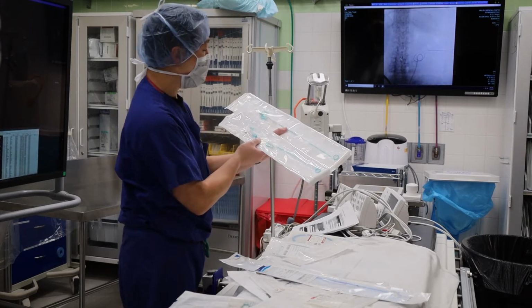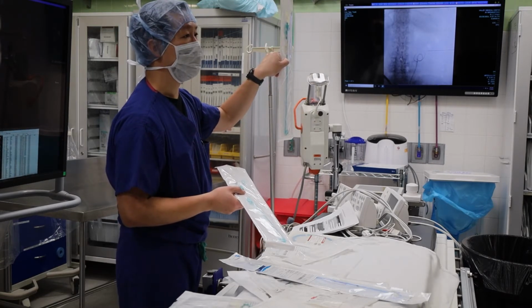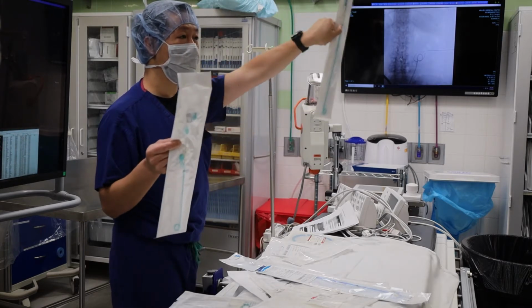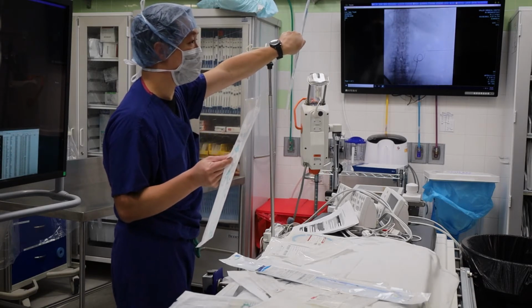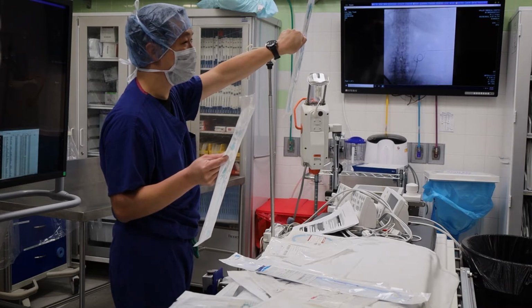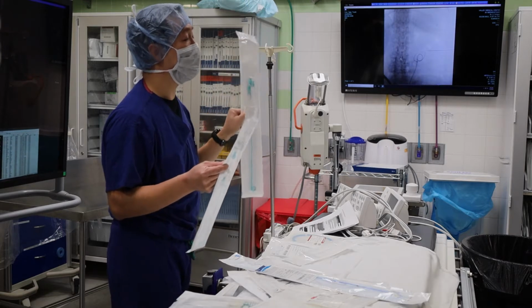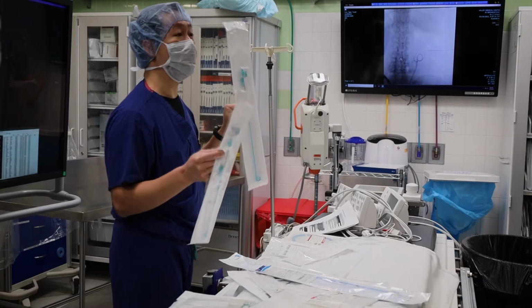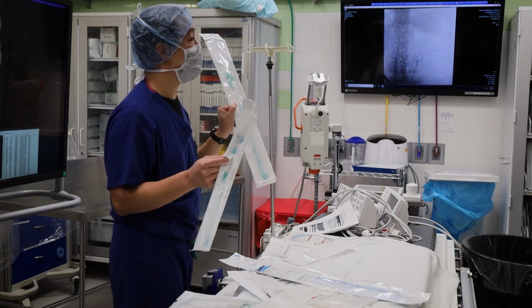Okay, so what sizes do these come in? 8, 10, 12, 14, 16. These or these? The Nephs go up to like 12, right? Or not, you tell me. 8, 10, 14. 6. I think there's no A's because they get caught. I know for sure that all the companies make perc Nephs in 8 and 10. I would not know if they make it bigger than that. Yeah. Okay, I just don't know because it's extremely rare.